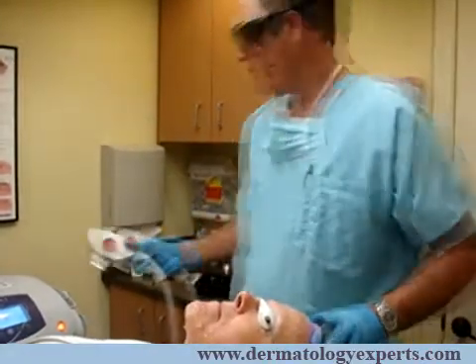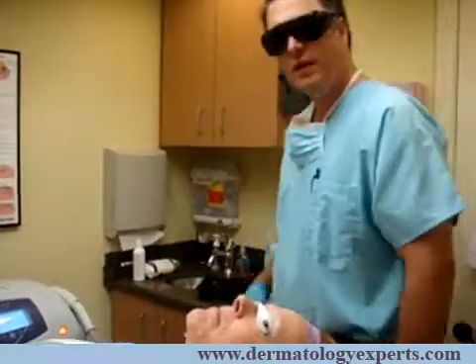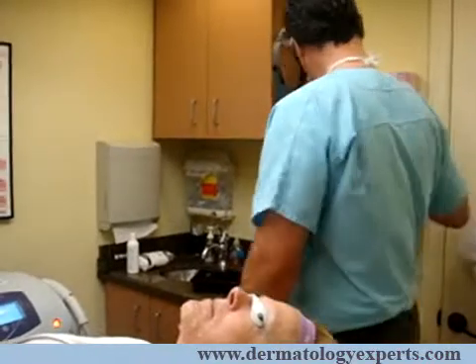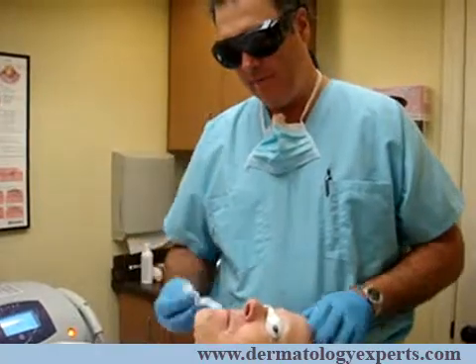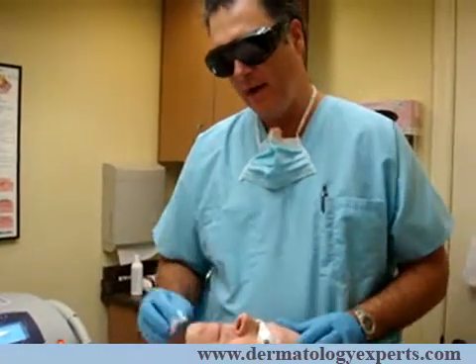And that's it. The patient will be a little pink for about a half hour, and I'll ask them just to put a little sunblock on. Otherwise they'll come back in about three weeks for an additional treatment. Thank you for joining us today. This is Dr. Morgan O'Donoghue at O'Donoghue Dermatology demonstrating hair removal with the Intense Pulse Light device.